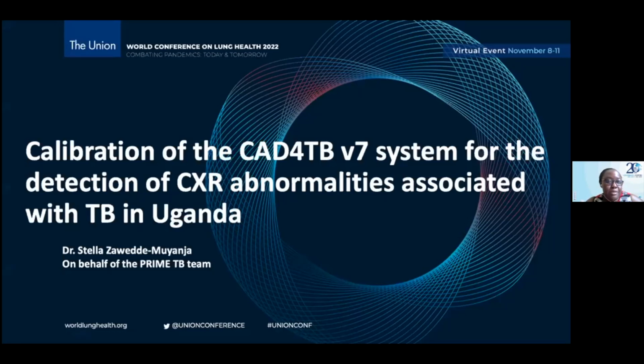As we heard from previous speakers, the CAD4TB comes with many user options, and one of them is a prescribed threshold score, but also with the liberty to titrate it and calibrate it for specific populations. So that's what we set out to do for the Ugandan population.